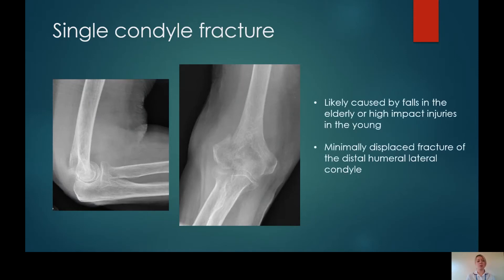This is an example of a single condylar elbow fracture. Although the lateral condyle has been fractured here, it is of course possible to fracture the medial condyle as well. These are most likely caused by falls and are quite unstable fractures.